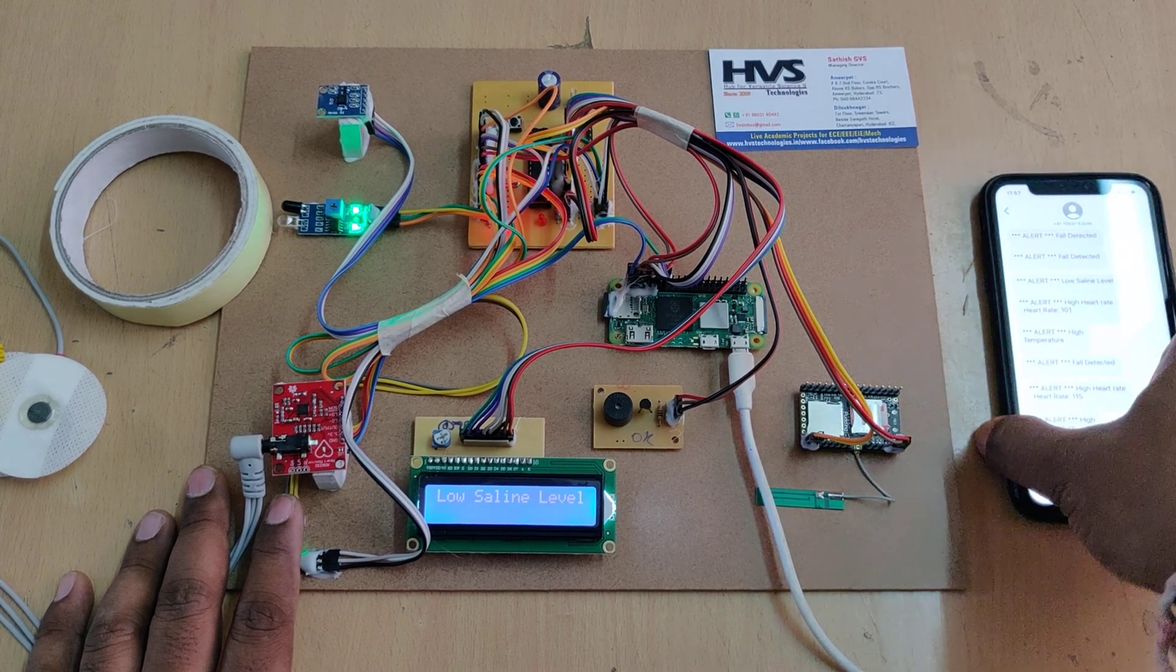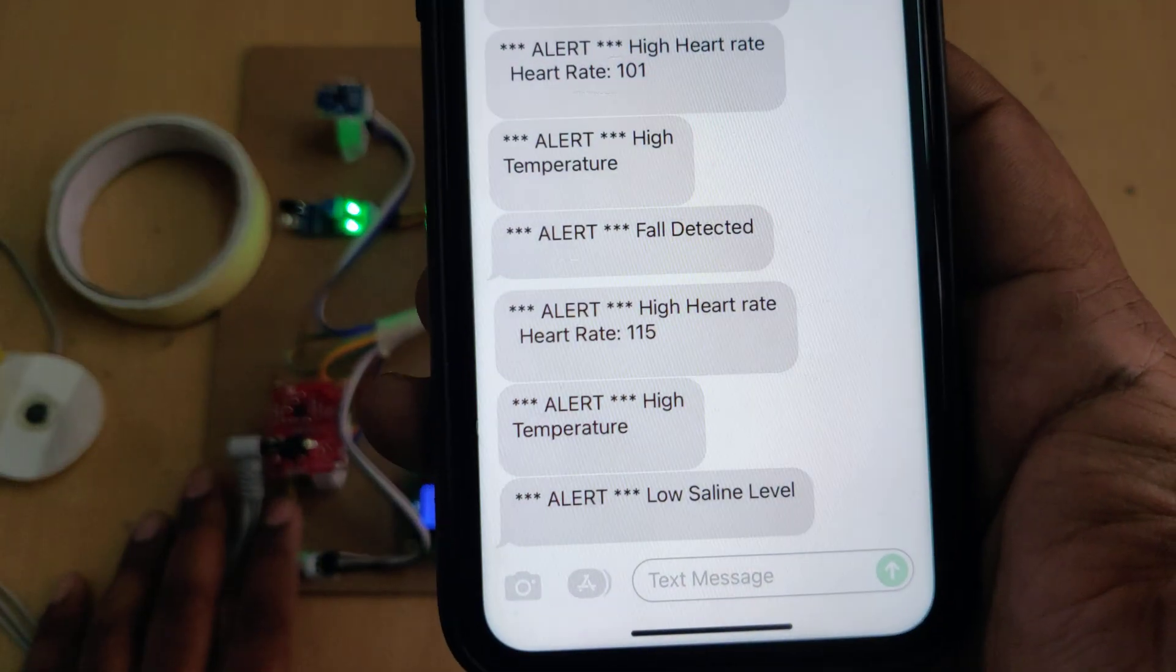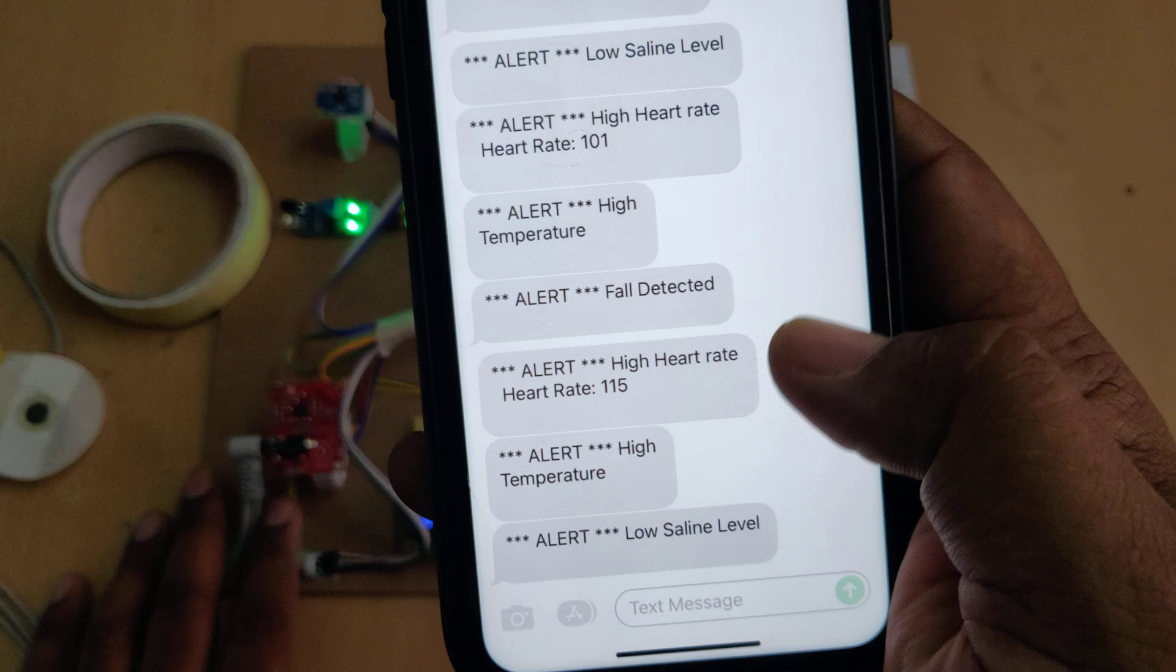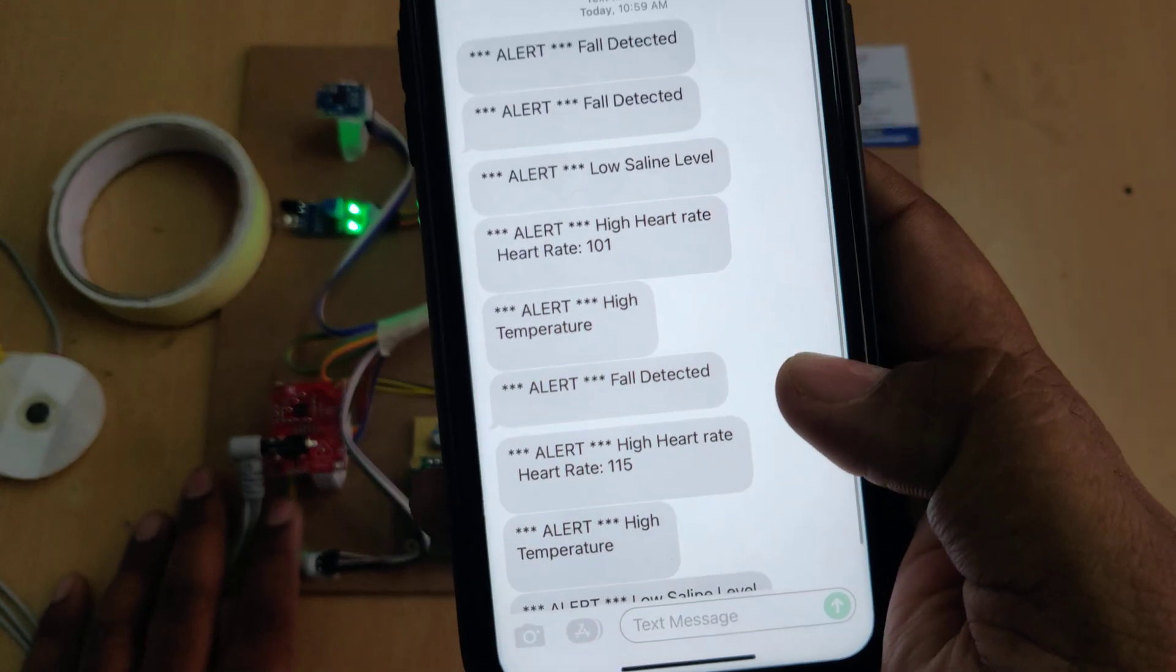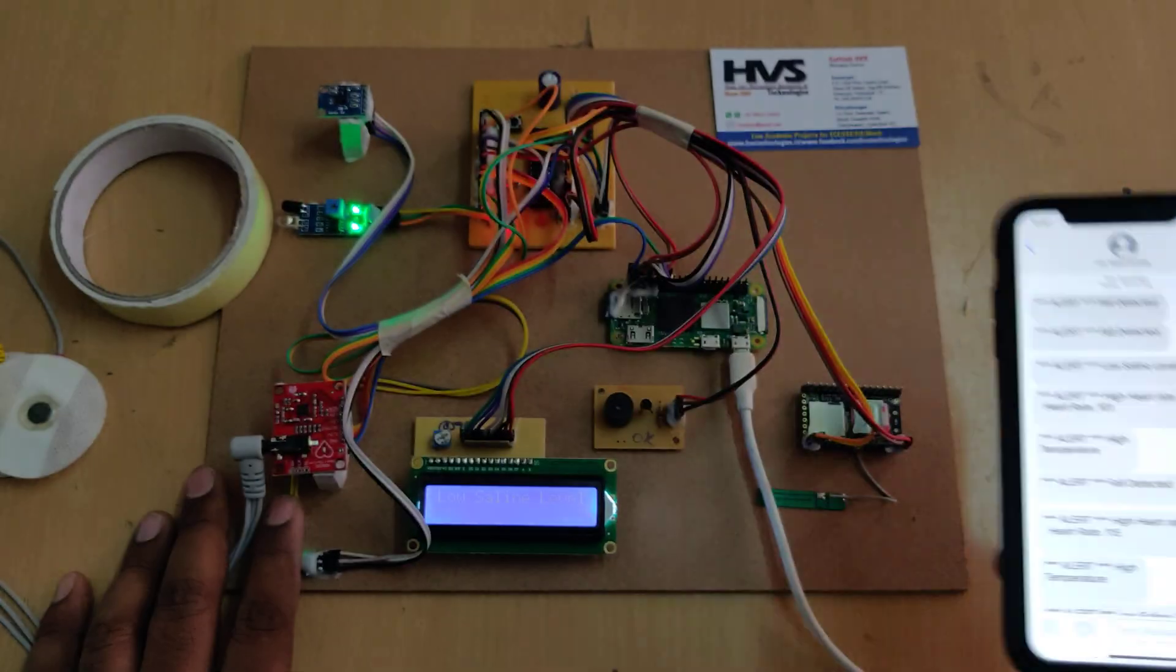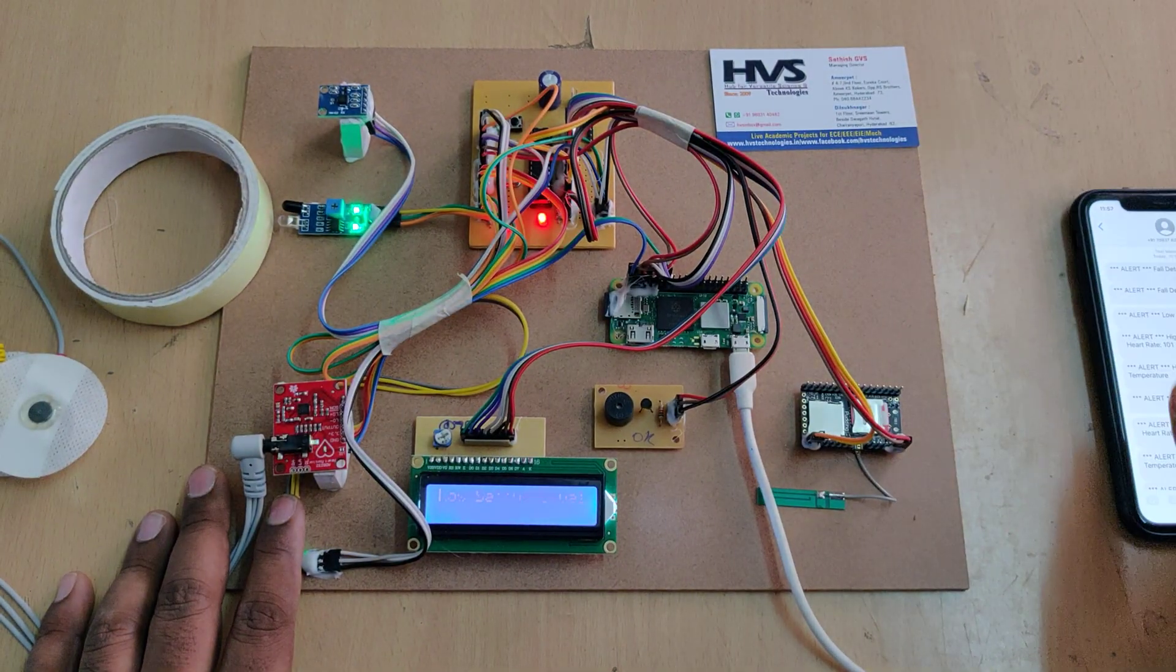We received the low saline level alert. Let's test the fault detection next.